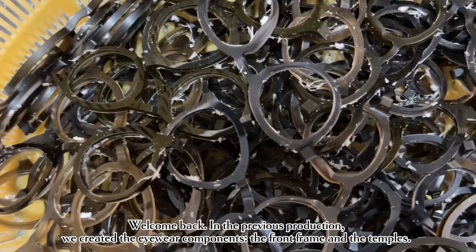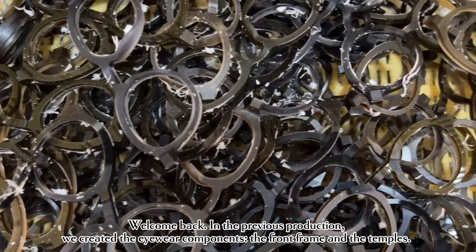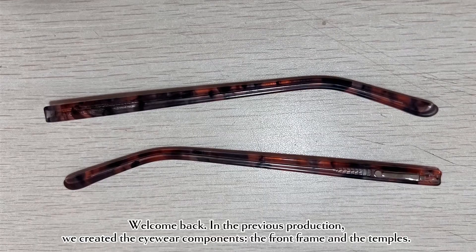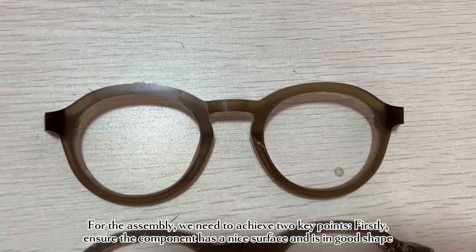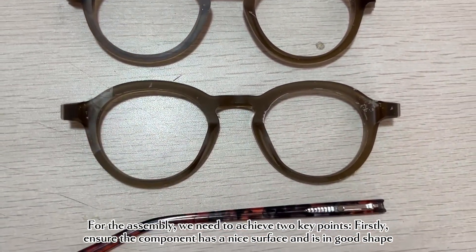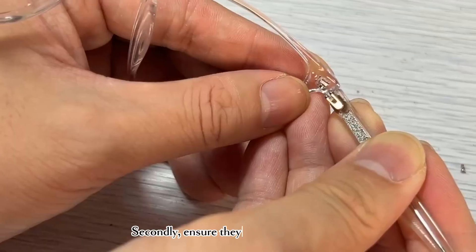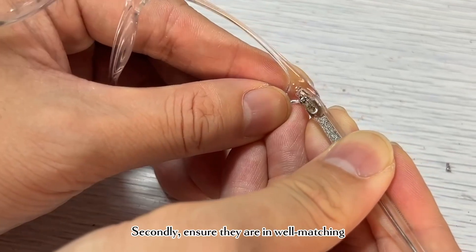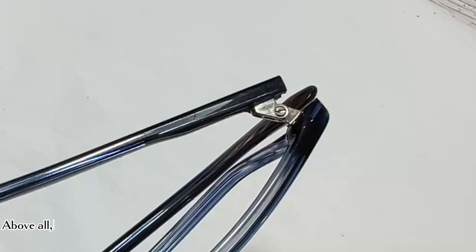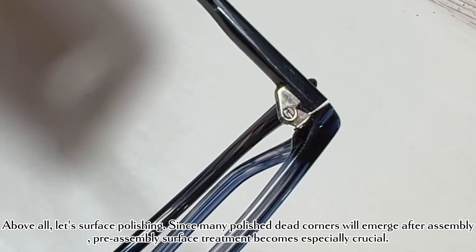Welcome back. In the previous production we created the eyewear components — the front frame and the temples. For the assembly we need to achieve two key points: firstly, ensure the components have a nice surface and are in good shape; secondly, ensure they are well-matching. Above all, let's address surface polishing, since many polishing dead corners will emerge after assembly.